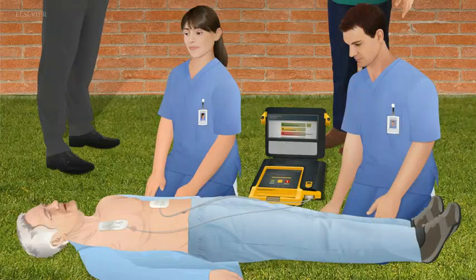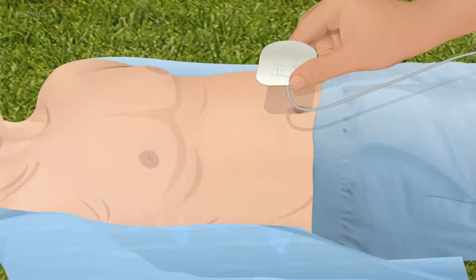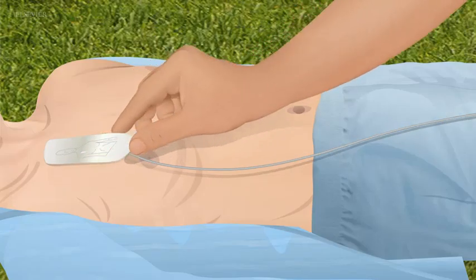Inspect the AED pad's adhesion to the patient's chest wall. If the pads are not in good contact with the skin, remove the pads and apply a new set.